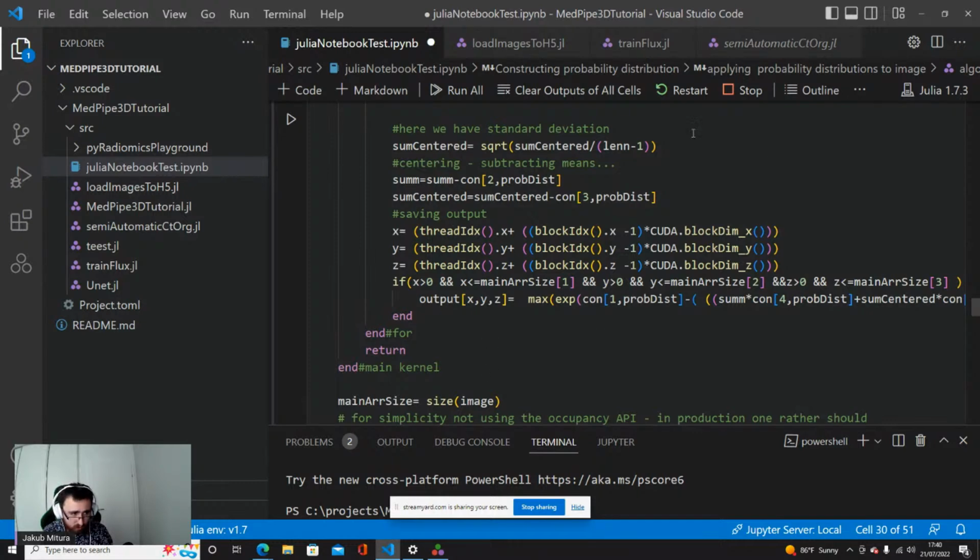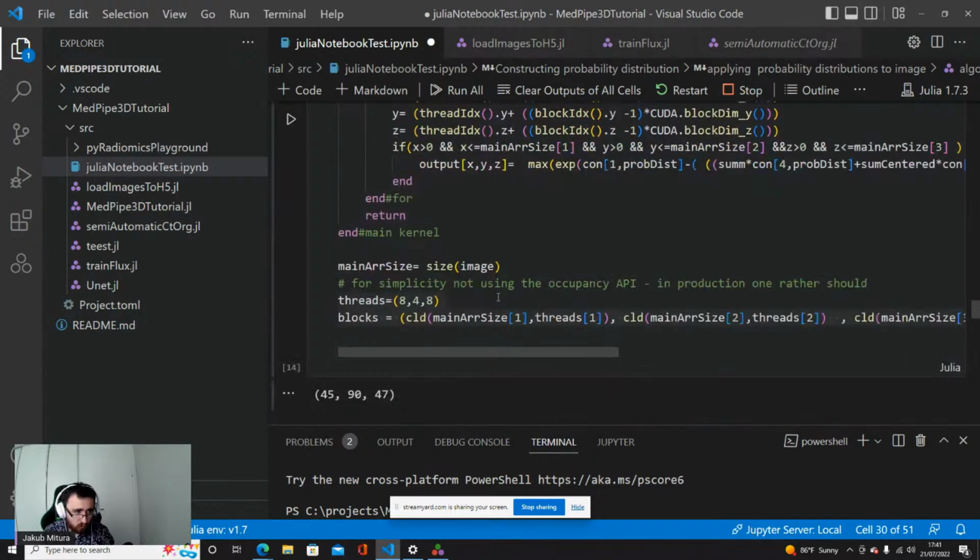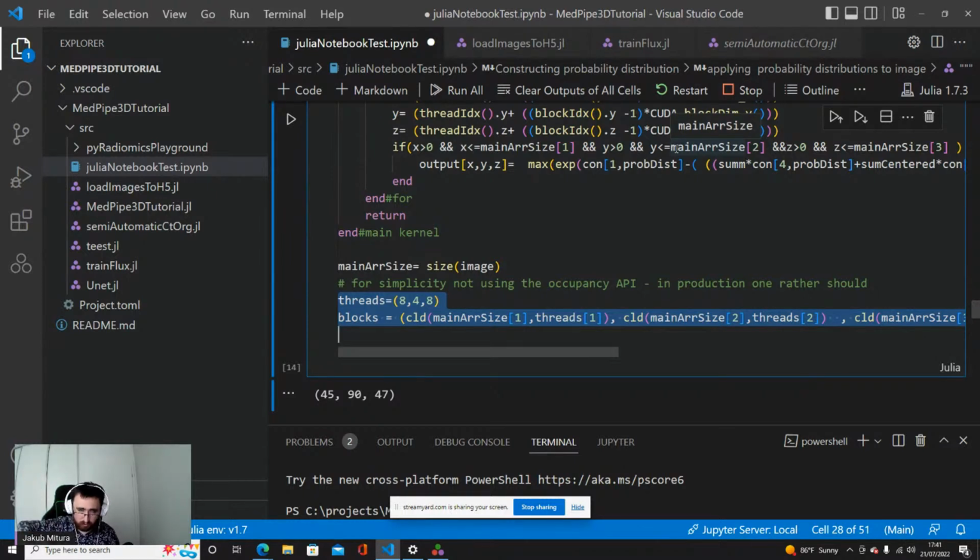Yes, this is three-dimensional, but when it is two-dimensional, and each thread block gets one layer by one layer, it goes just down. Also, it's very nice if the data is binary, for example, you can represent the data in binary format, for example, encode the integers in the bit representation of the integers. It's then easier to get memory coalescence.